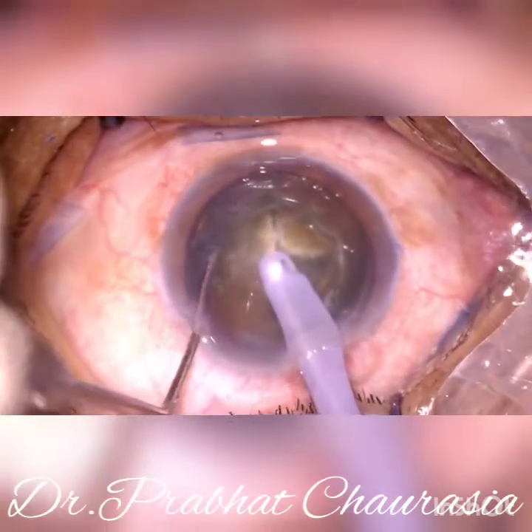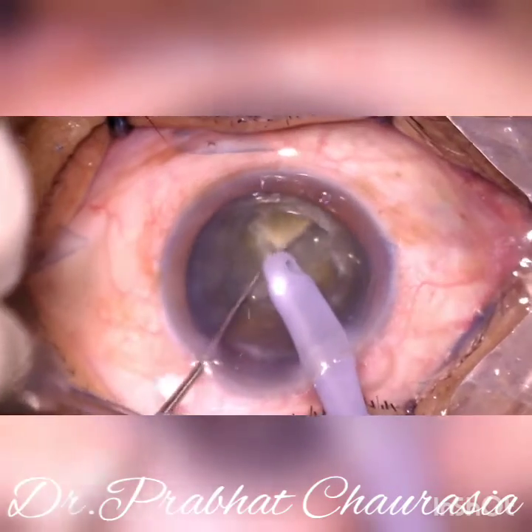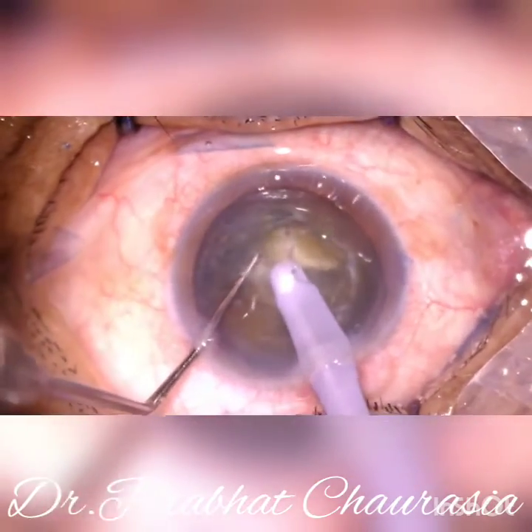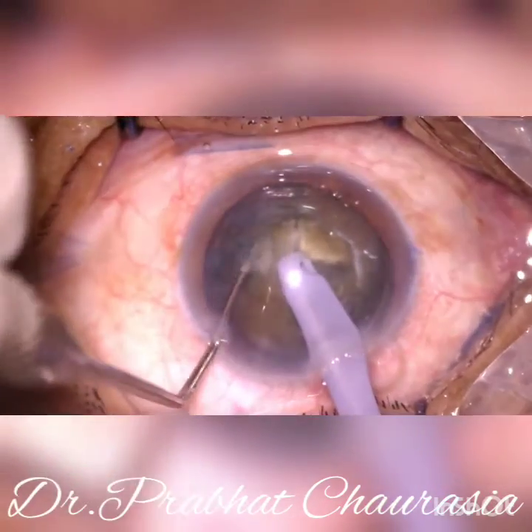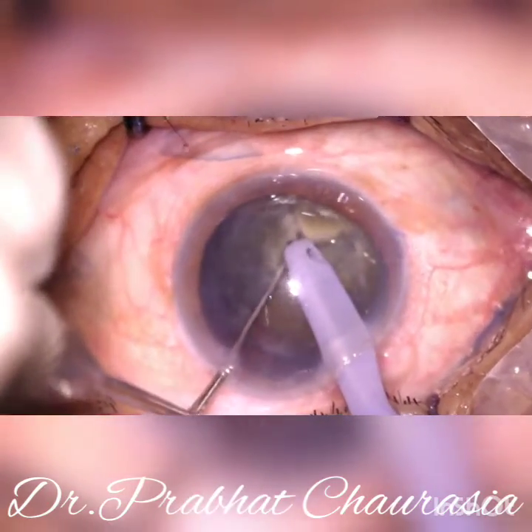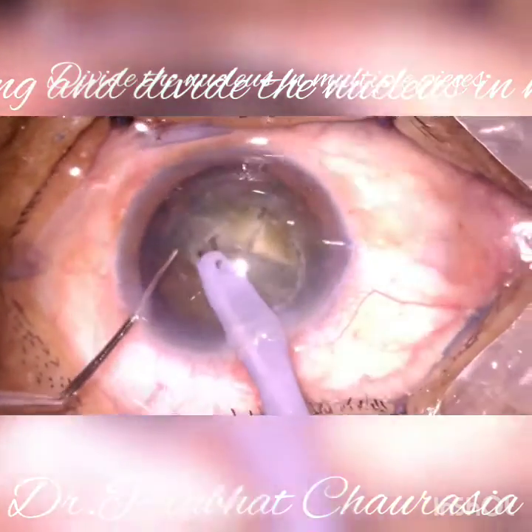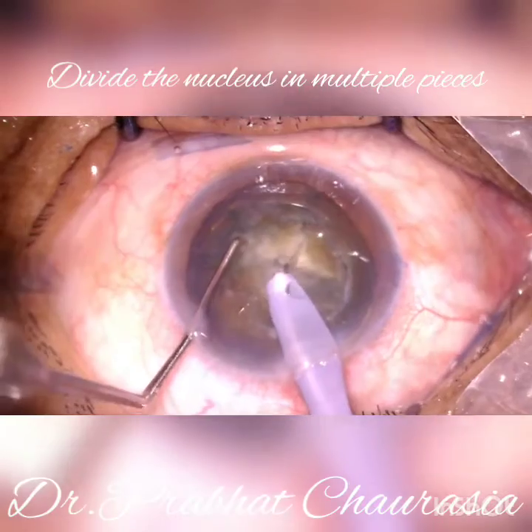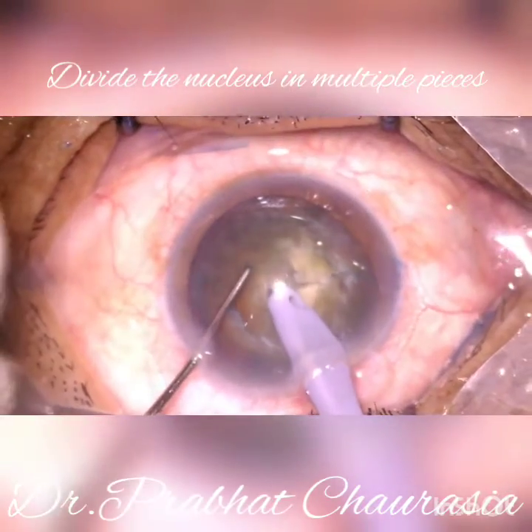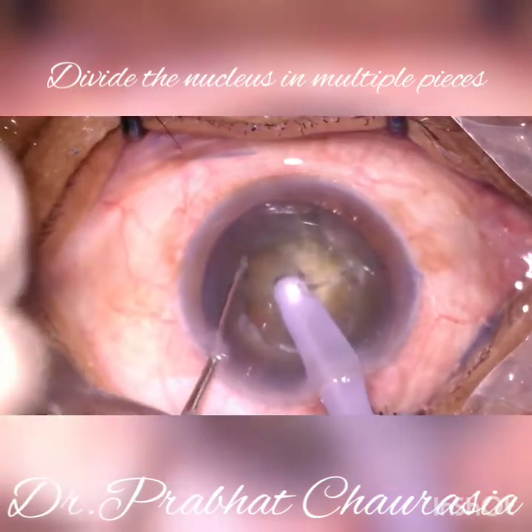Embed the phaco tip, build up some vacuum, hold the nucleus, and then chop it. Make multiple chops like this.